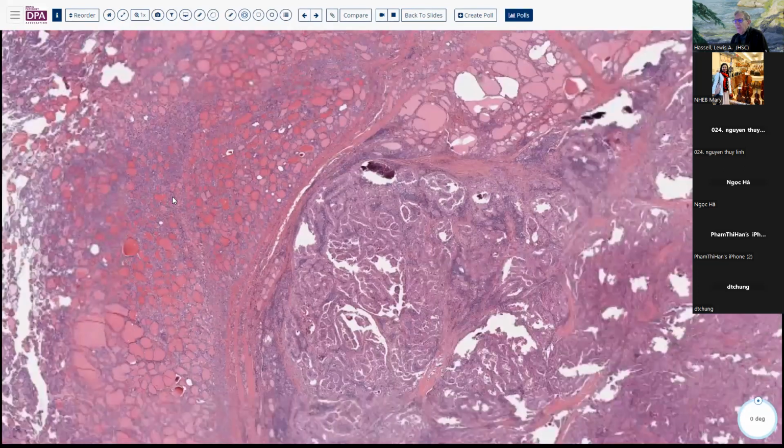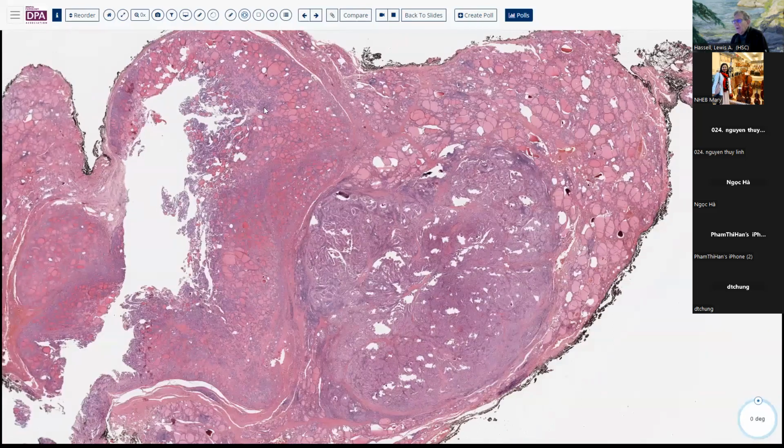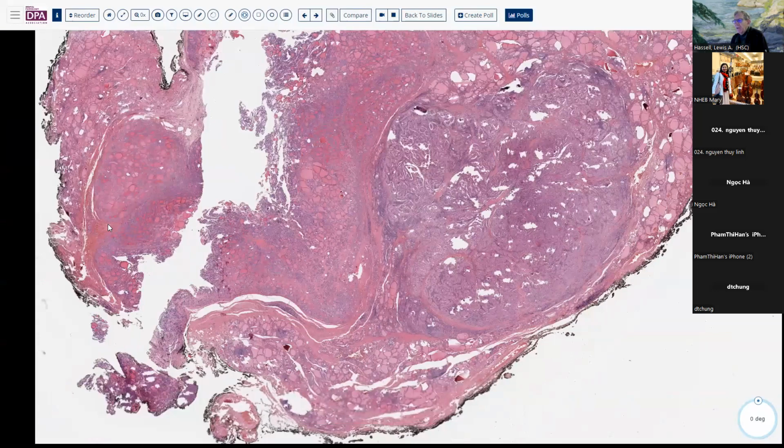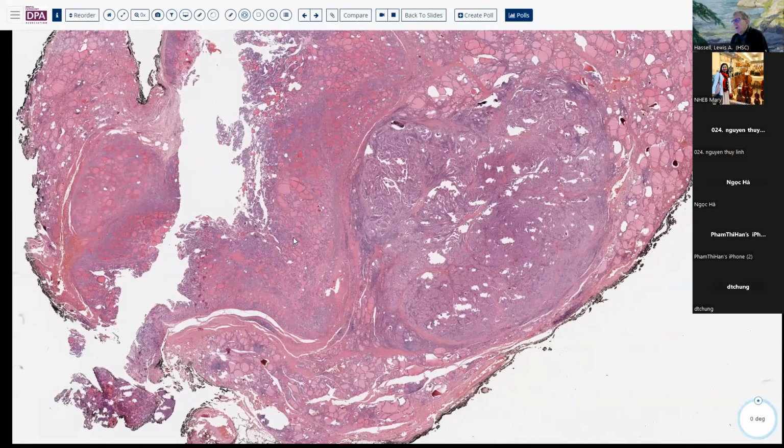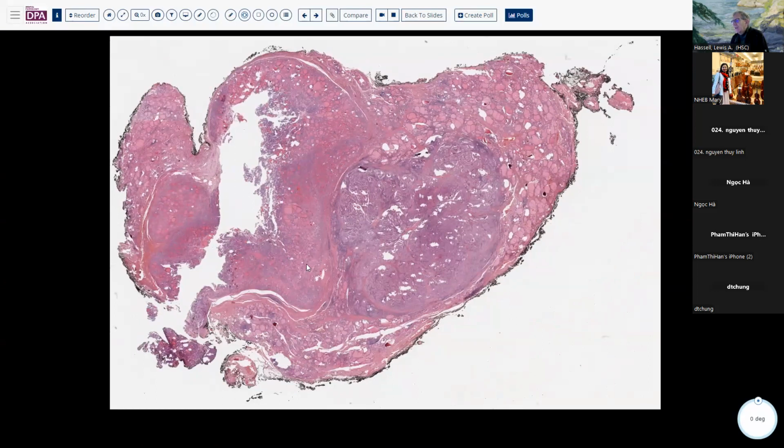And so this, I think, is a classical papillary thyroid carcinoma, as well as our new encapsulated follicular lesion with nuclear features resembling papillary thyroid carcinoma, or the NIFT-P. So a nice comparison back to back of how those lesions are similar and how they may differ somewhat.